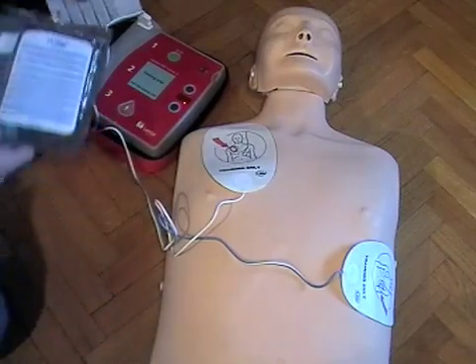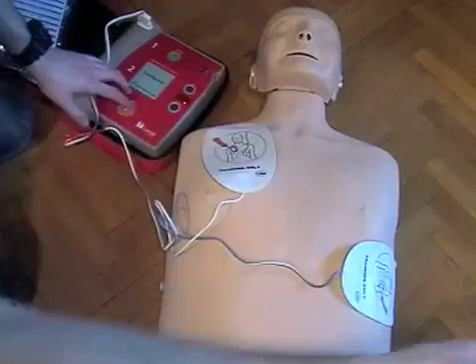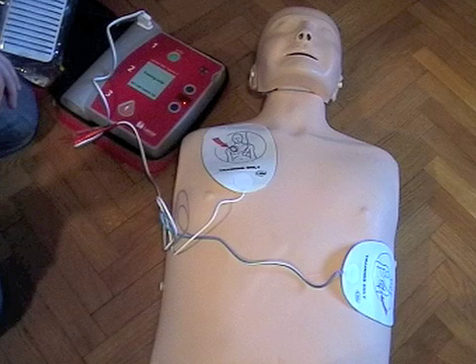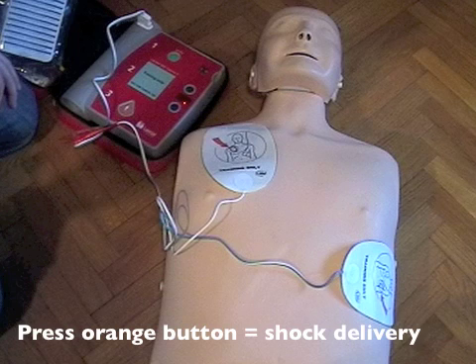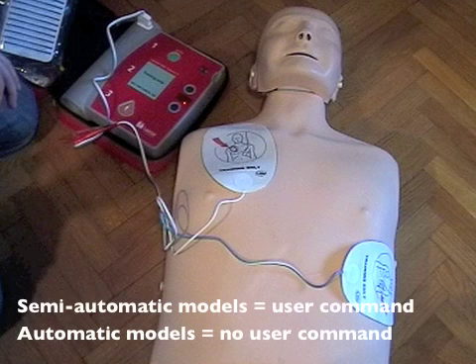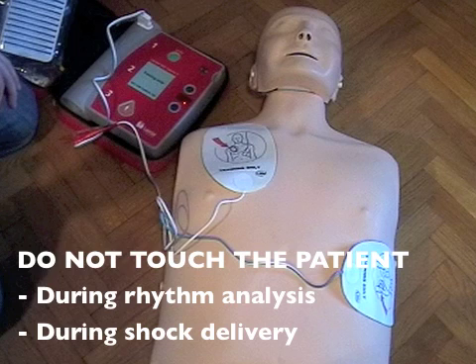The AED announced: 'Shock advised. Charging. Stay clear of patient. Deliver shock now. Press the orange button.' After analysis, the AED may or may not recommend shock depending on the underlying heart rhythm. In this case, it recommended shock and charged its capacitor automatically, instructing the rescuer to deliver shock by pressing the orange button. Most AEDs will not deliver shock on their own but require the rescuer to do so. However, some will both charge and deliver shock on their own. It is extremely important not to touch the patient during shock delivery. The rescuer must assure no one, including himself, is in contact with the patient before pushing the shock button.